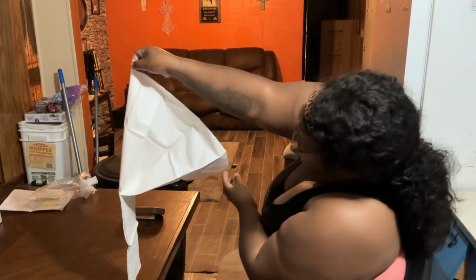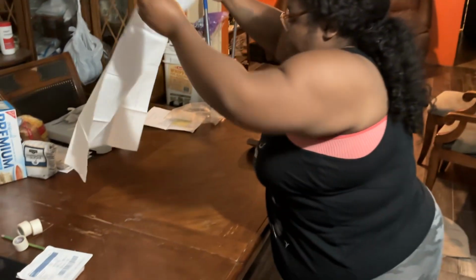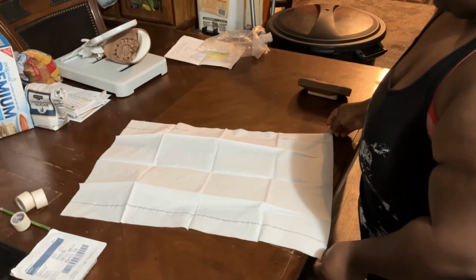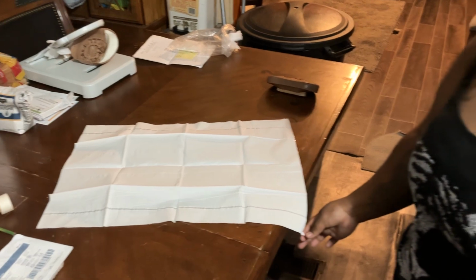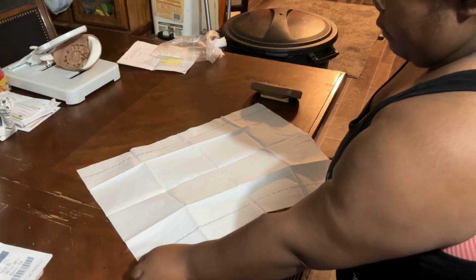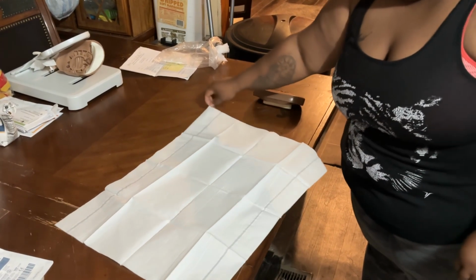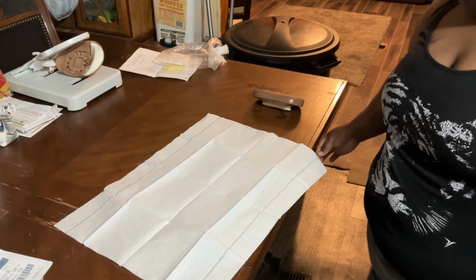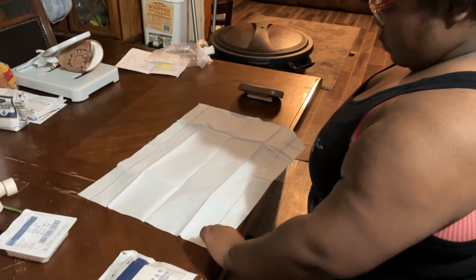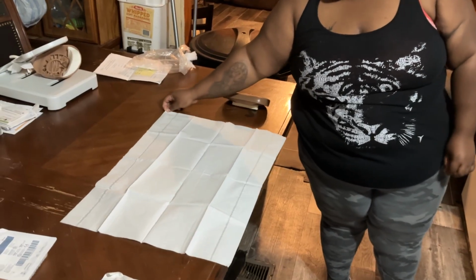Touch it using my 1-inch border. So just take my 1-inch border and turn it like such. Careful not to lean over my sterile field. I'm not going to lean over my sterile field. Go to the side of my sterile field to fix it.